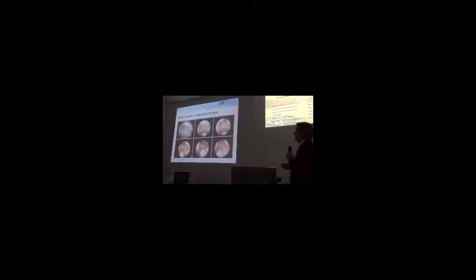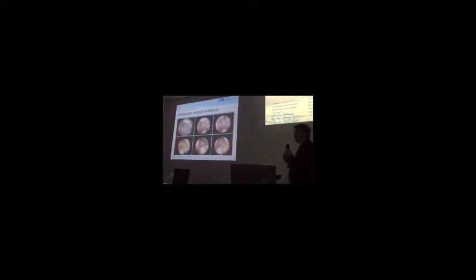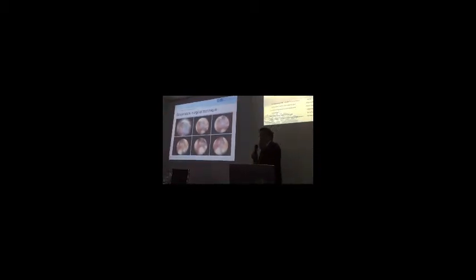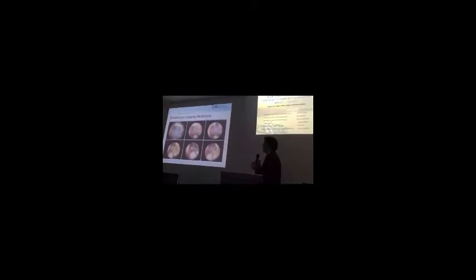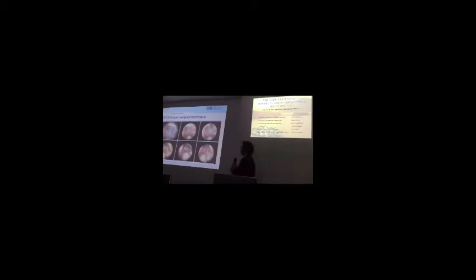You see this is a nice colloid cyst bulging in the lateral ventricle. Then usually we coagulate the cyst, and then we have seen some images in the first talk today. You decompress the structure. You can sometimes aspirate, and then you use irrigation, and step by step you remove the lesion.